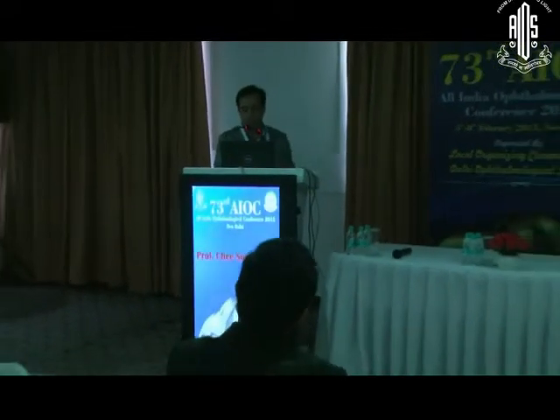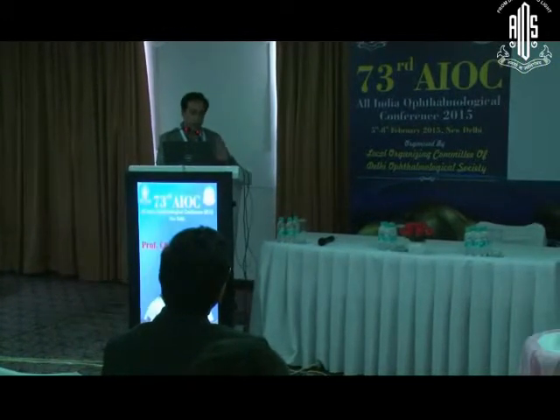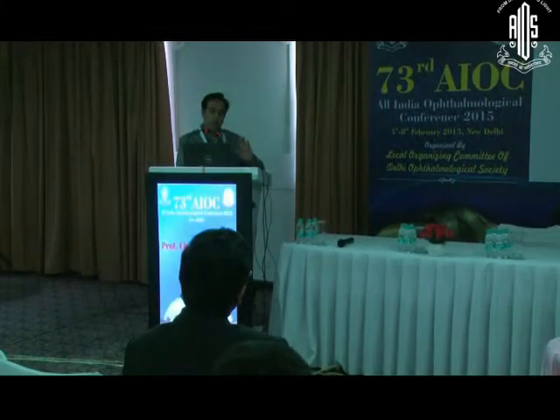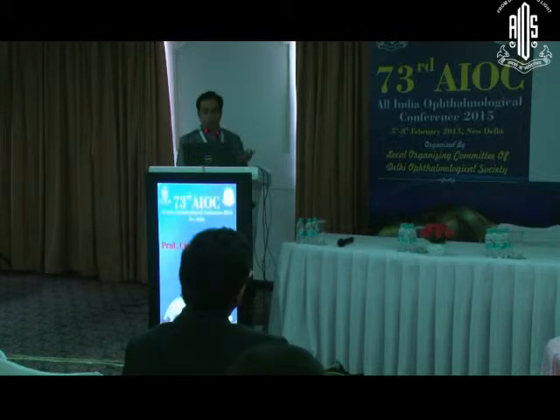Actually, with the Constellation, there's a proportional, linear control. You could have a preset of maybe 100%, but as you tap the foot switch you get an increase: 5, 10, 15, 20, 30. The minute you feel you've got an adequate reaction, you could stop. Or if you like to have a preset of 20, 30, 40, you could just keep it there and press it fully also.